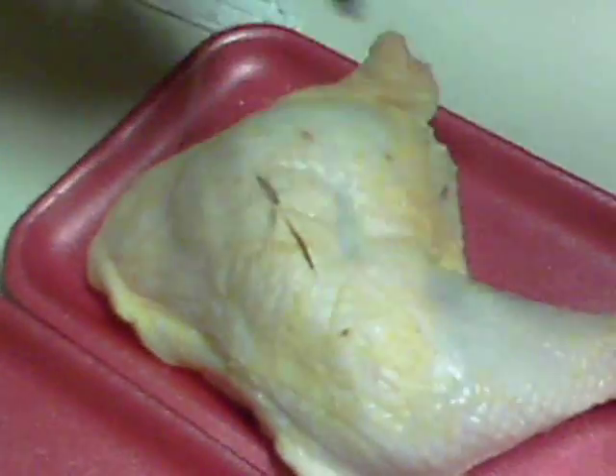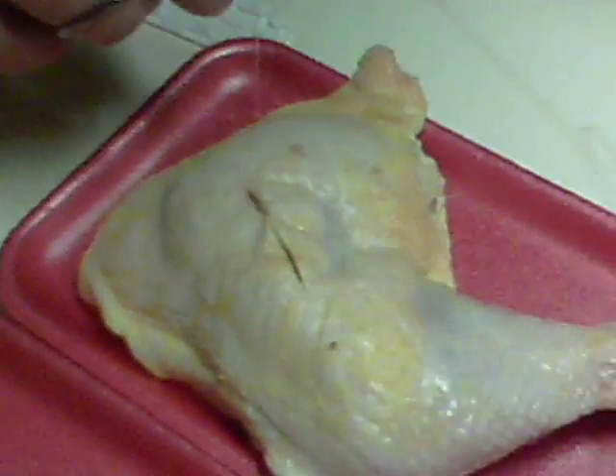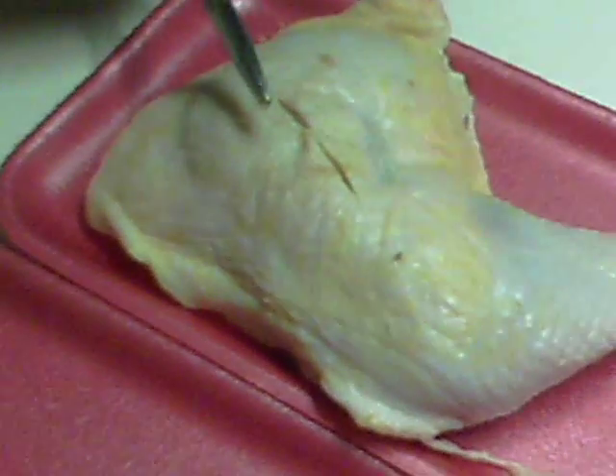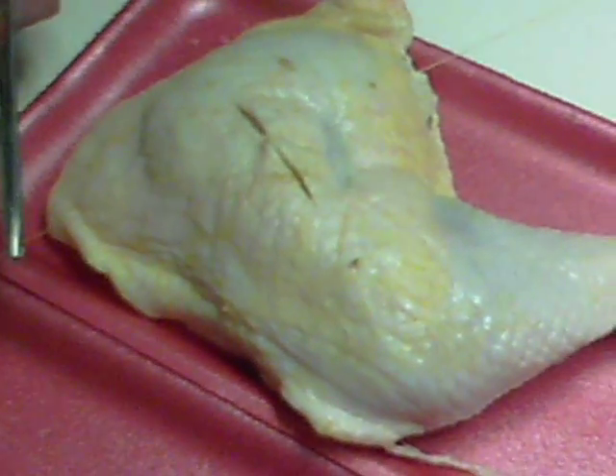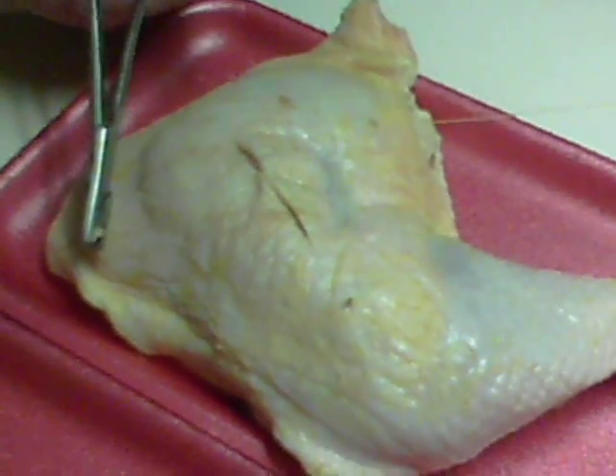Now you don't want it too tight, or else you'll kill the skin. So then you grab it again, go the other way. And then one to the inside. One thing to remember — I use silk primarily, or ethylon — this is just a quick fix. Get actual medical attention for it. This is not supposed to be the end-all do-all in your particular case.